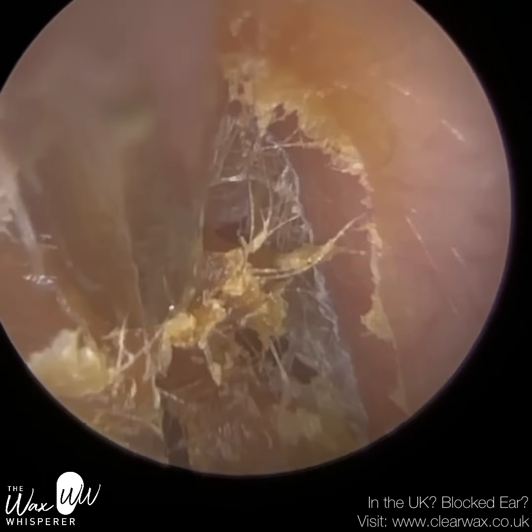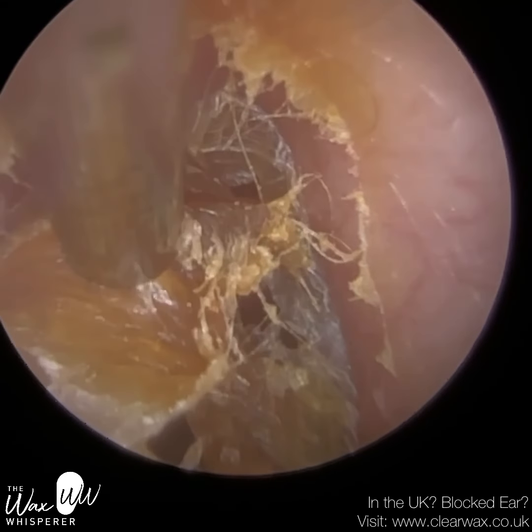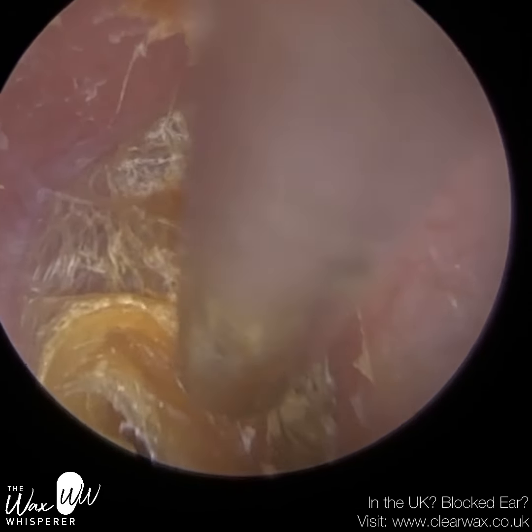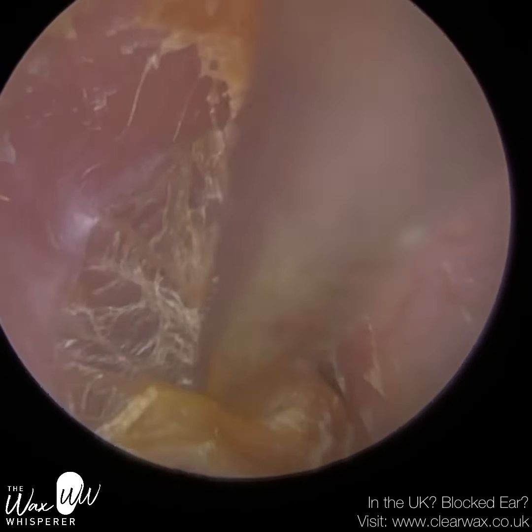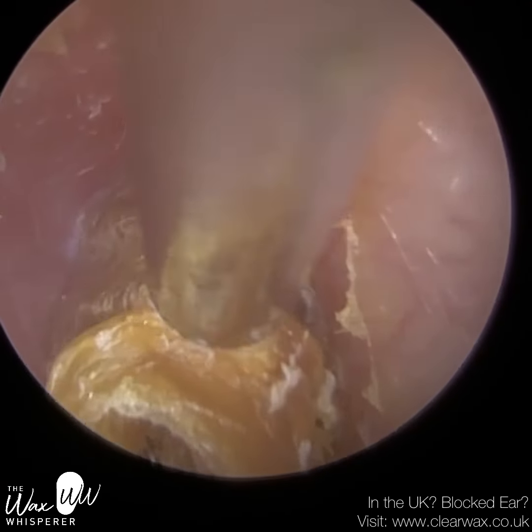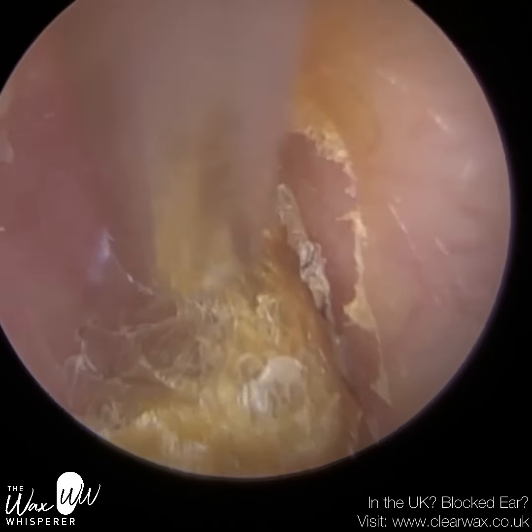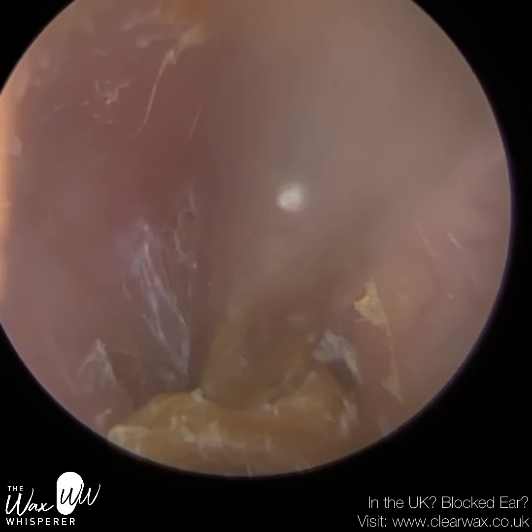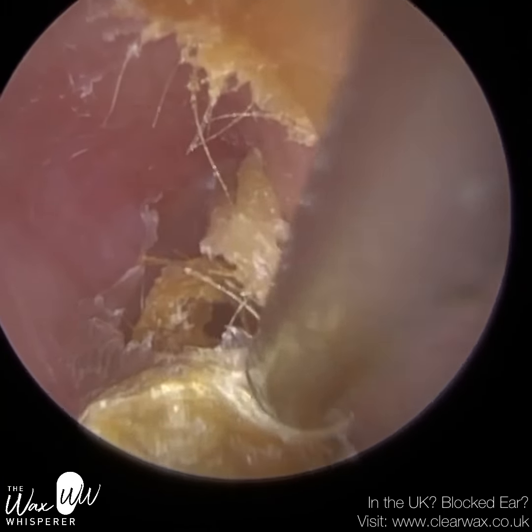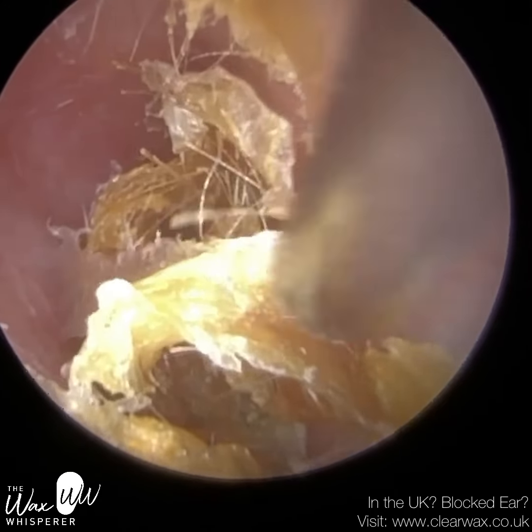You'll see that in a moment — when I first looked at the eardrum I didn't think there was a layer of dead skin on it, but as I was peeling this away you could see the skin coming away from the eardrum. So I've just peeled it from the roof and then gone into the back part of the ear canal. This is the right ear, and once more this skin that I'm peeling away was on the eardrum originally — it's just died and shed. But it hasn't migrated out of the ear as it does for the majority of us; the skin just kind of should migrate out of the ear.